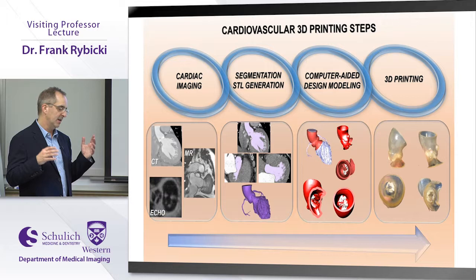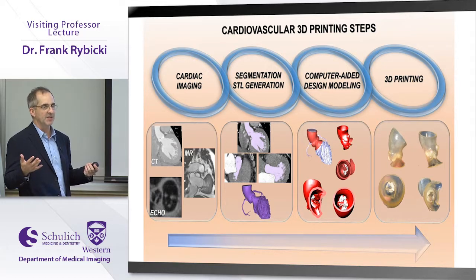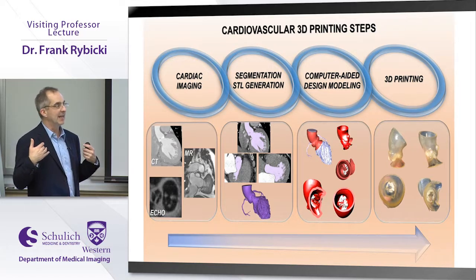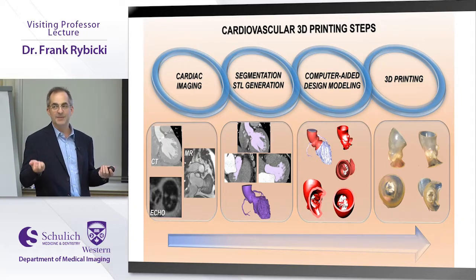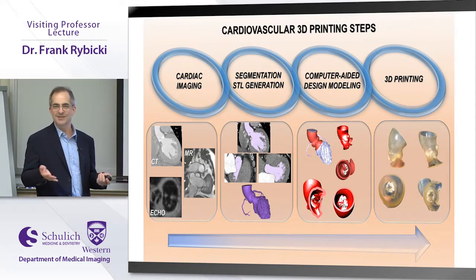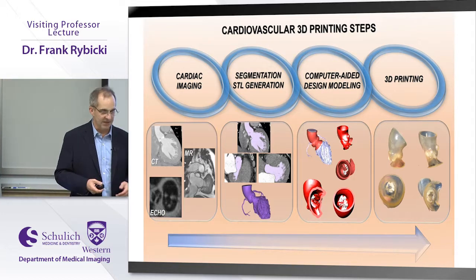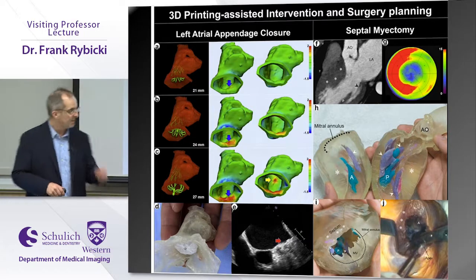You can have parts of it that have to be eliminated. It can have holes, which are non-anatomical things that won't be recognized by the printer. You can actually have a set of DICOM images and have a vessel wall, and the wall thickness be 0. Right? But you can't tell that to a 3D printer, because you can't 3D print 0. You have to 3D print something. So there's all kinds of different types of modeling that needs to happen before you actually hit the button.